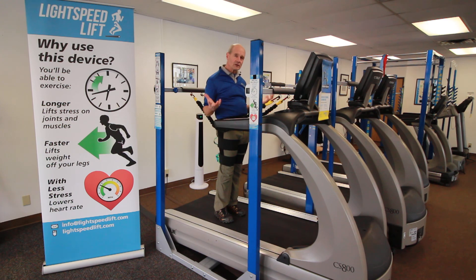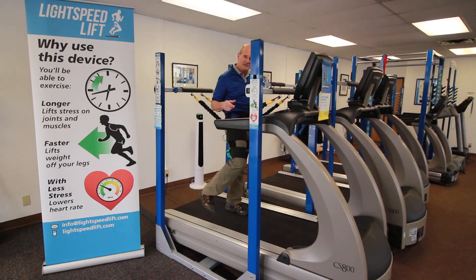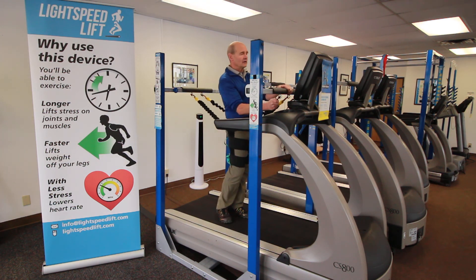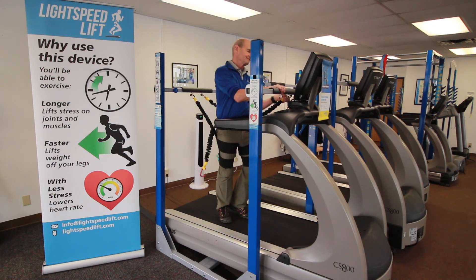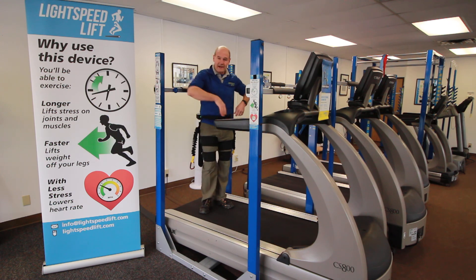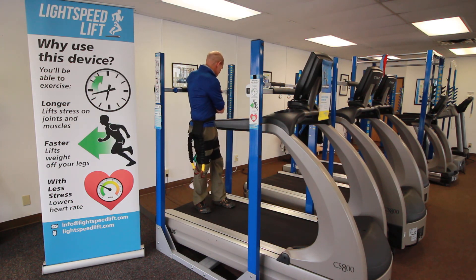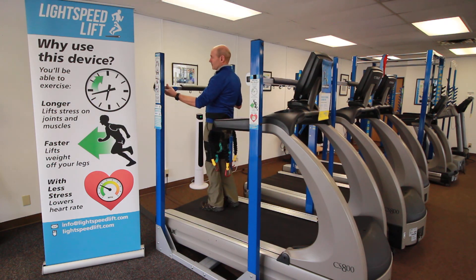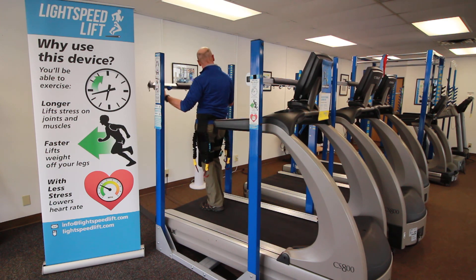If people are still not quite feeling comfortable — and you'll get a pretty quick sense even before you start the treadmill moving — here's how you change it. Unhook the front, unhook the back. Lift the front up one notch. Lift the back up one notch.